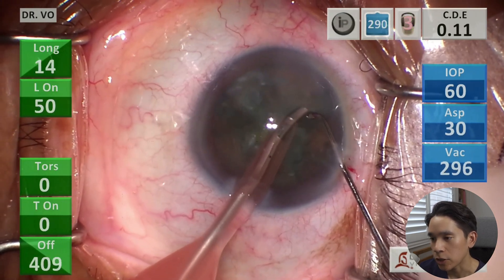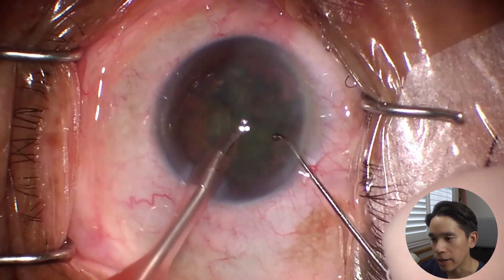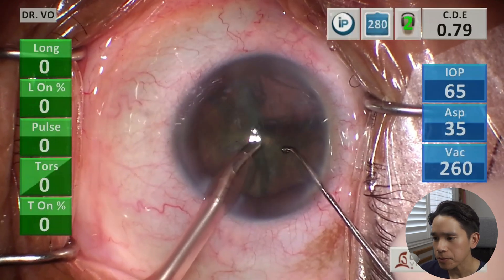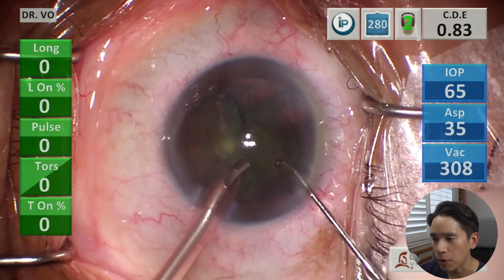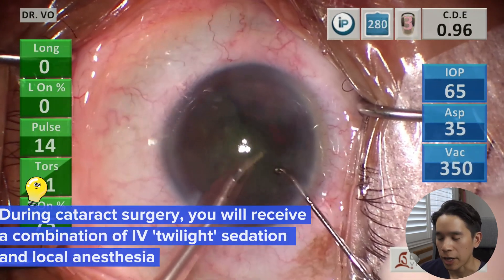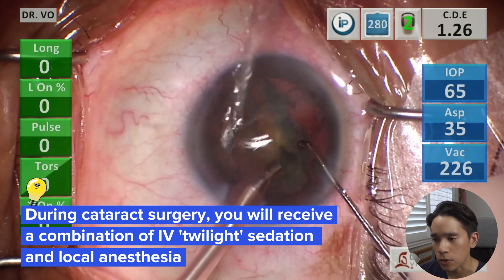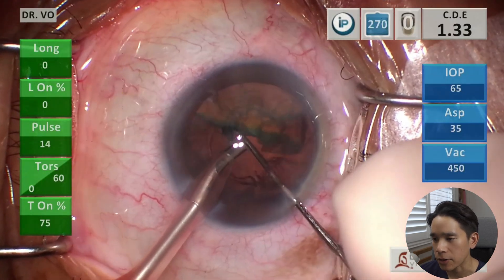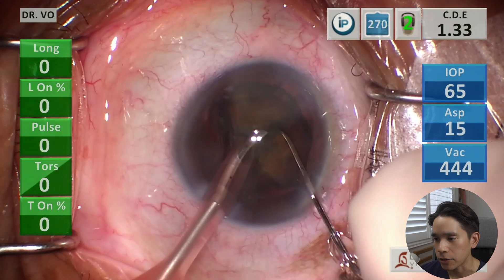One thing that patients always want to know during cataract surgery is: are they going to be awake? Are they going to feel any pain? And the short answer is no. For most surgeries, you will receive a combination of both light sedation through an IV and also local anesthesia, as I mentioned earlier. But if during the surgery you're feeling pain or having discomfort, just let your surgeon know — they can certainly give you more medication during the surgery.